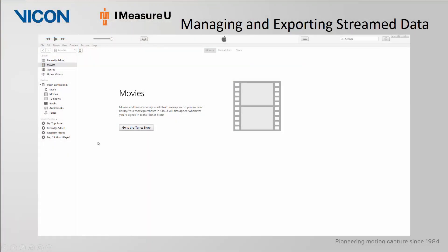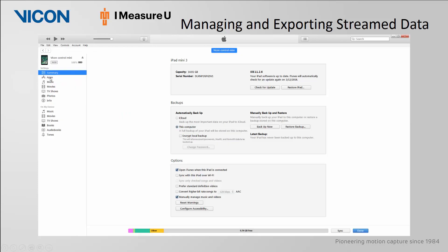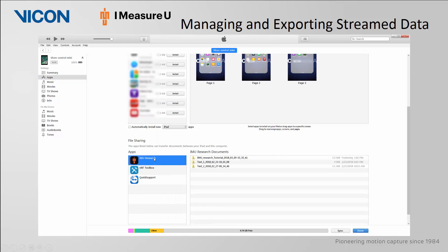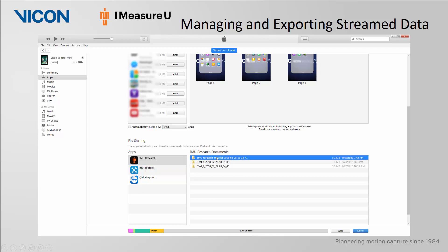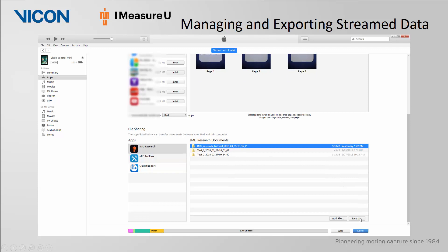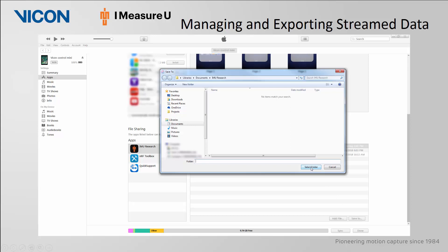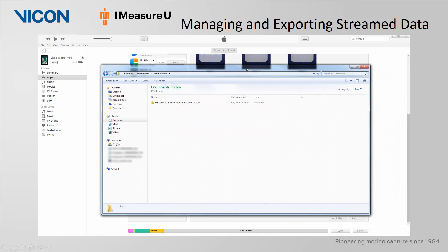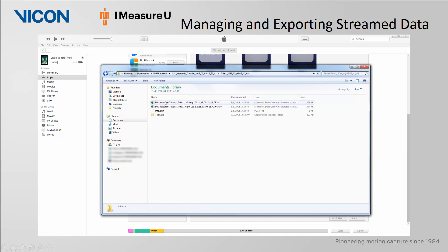You can also access the data by plugging in your iOS device into a PC or Mac and using iTunes. Within iTunes, click on the device icon and under Settings, click Apps. Scroll all the way down to File Sharing and click on IMU Research. This will show all trials stored on the iOS device. I will highlight my trial from IMU Research Tutorial and click Save To in the bottom right corner, specify the location, and click Select Folder. When opening the trial folder, you will see a CSV file for each sensor, identified by the session name, IMU Research Tutorial, the trial name, Trial 1, and the sensor name specified in the app — in this case, Left Leg 1 and Right Leg 1.